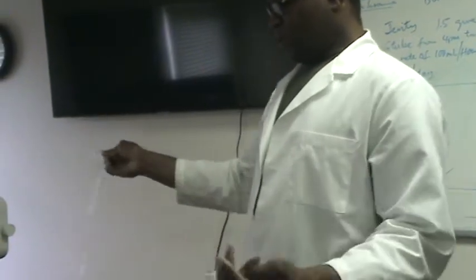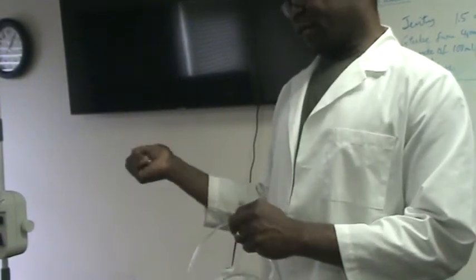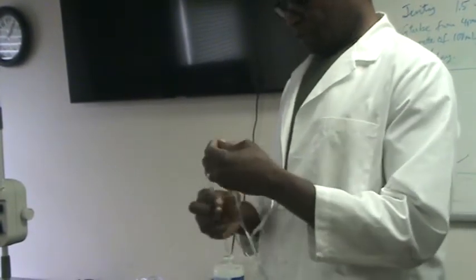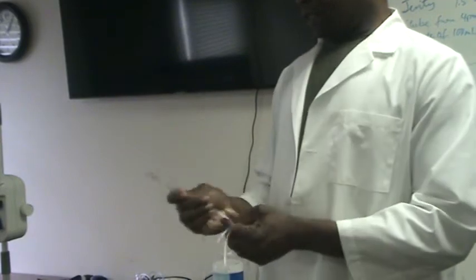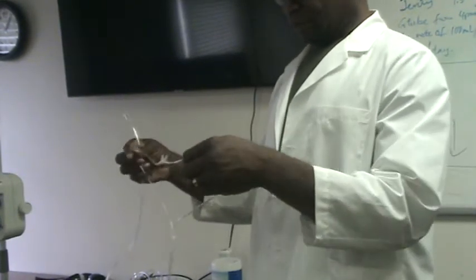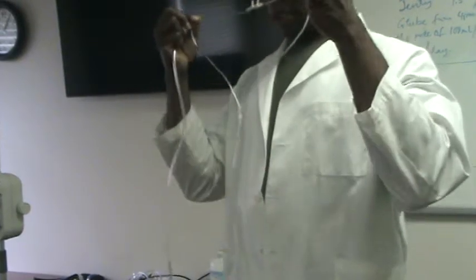So the cylinder is already set to deliver maybe 2 liters or 3, but most of the time it's 2. This connects to the cylinder, then this connects to the nostril, and you put it like that, something like this.